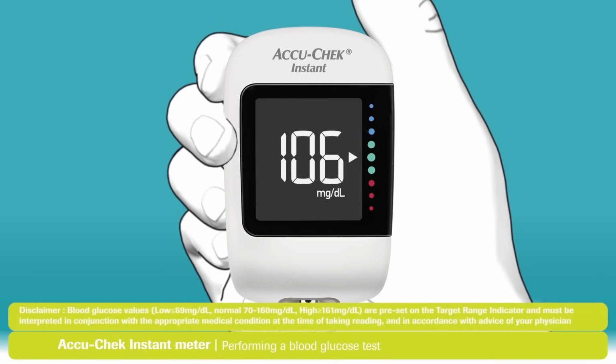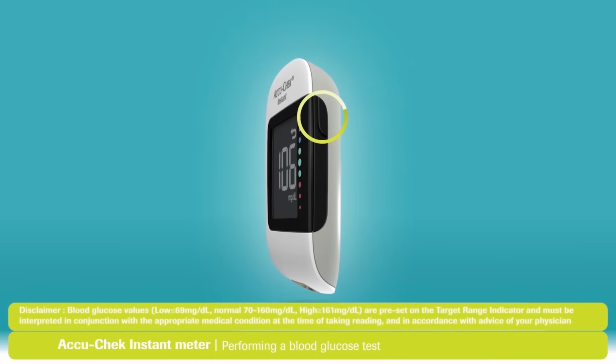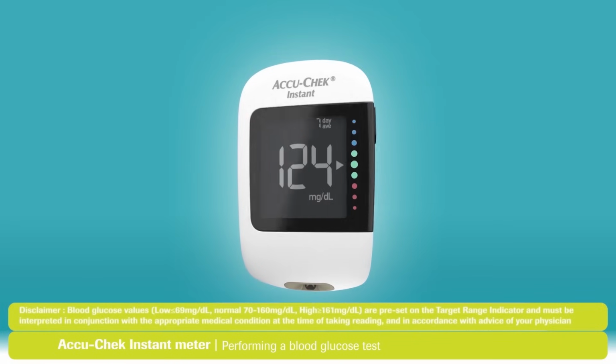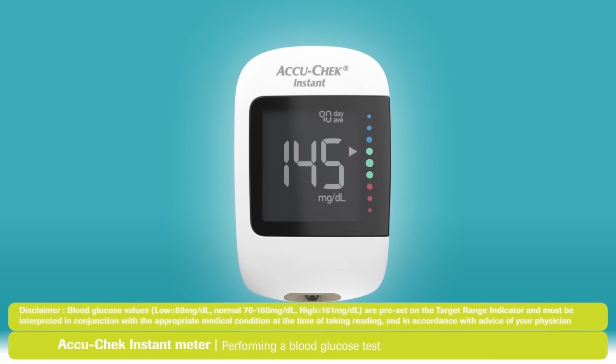When your test result appears, the arrow shows if your result falls above, within, or below the target range. The target range is represented by the green region of the target range indicator. The arrow will flash if your result falls above or below this range. The target range can be individualized to meet your personal therapy goals. If you press the button, you can view your previous 7, 30, and 90-day averages on your display.